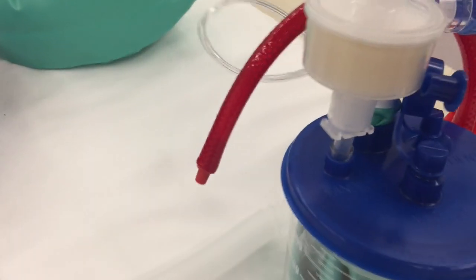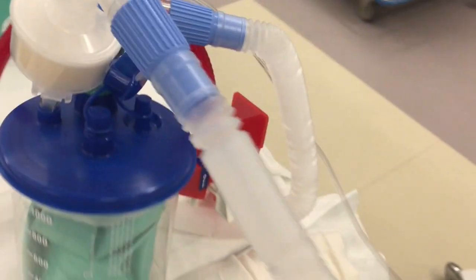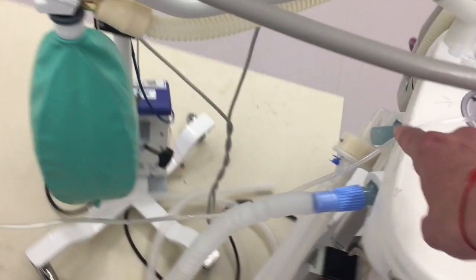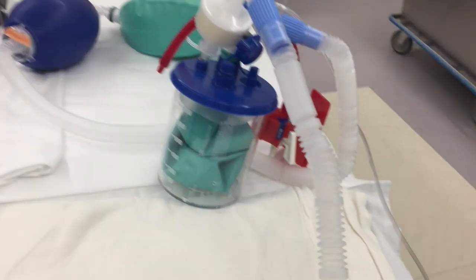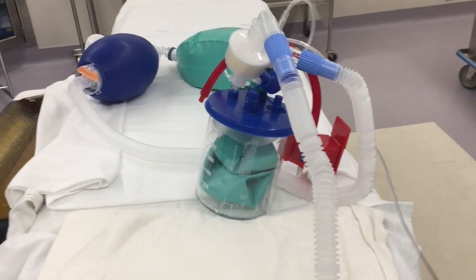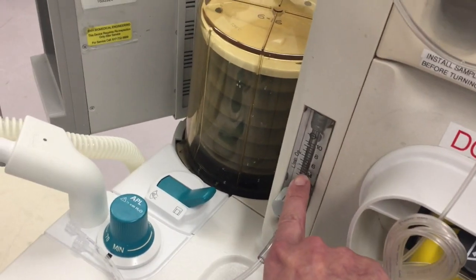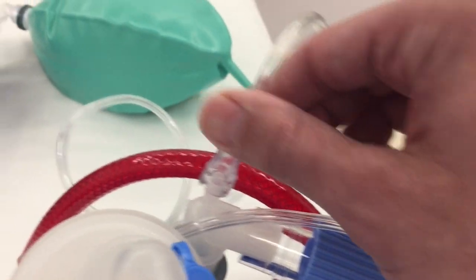So this is the setup that allows multiple patients to be ventilated using one ventilator. Each patient can have their own minute ventilation, which is controlled from the external oxygen flow. You can have an oxygen or air mixture going into here.